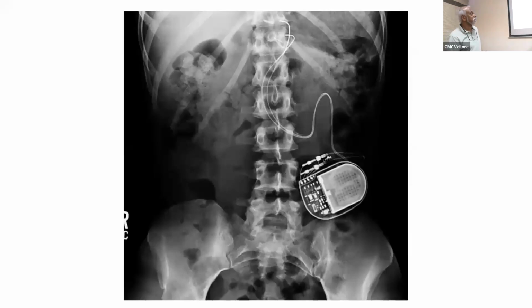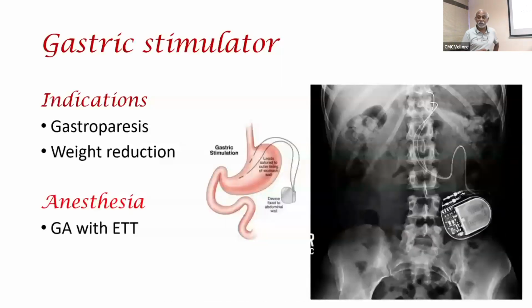Any guesses about this? Good guess. This is a gastric stimulator. You can see it's basically implanted into the curvature of the stomach and used for gastroparesis. And now it's obviously a treatment for weight reduction. It's a big thing to enhance the movement of the stomach.